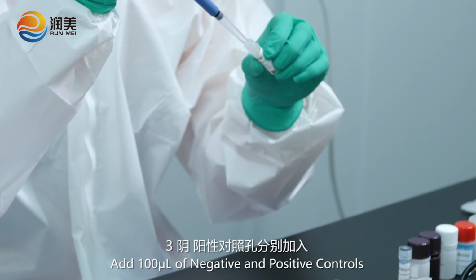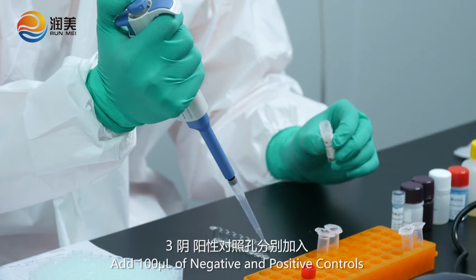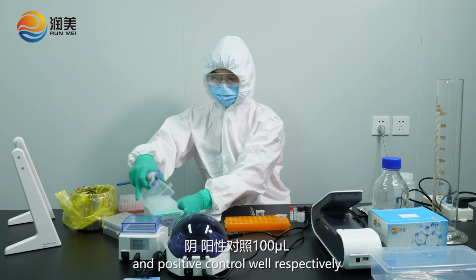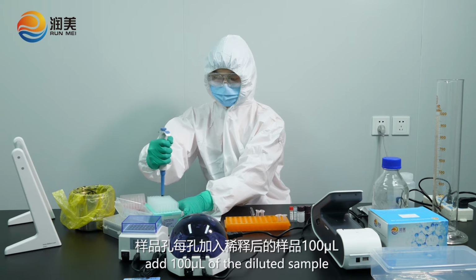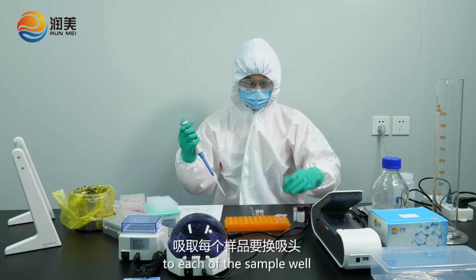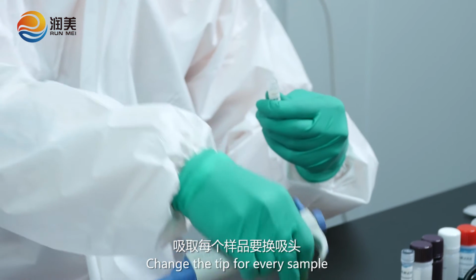Add 100 microliters of negative and positive controls to the negative and positive control wells respectively. Add 100 microliters of diluted sample to each sample well. Change the tip for every sample.